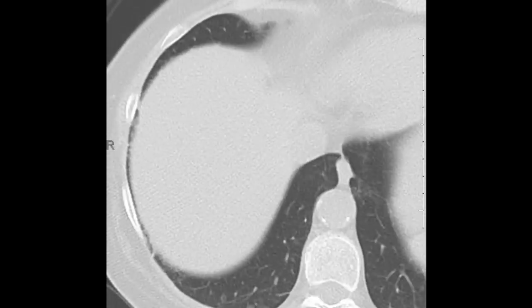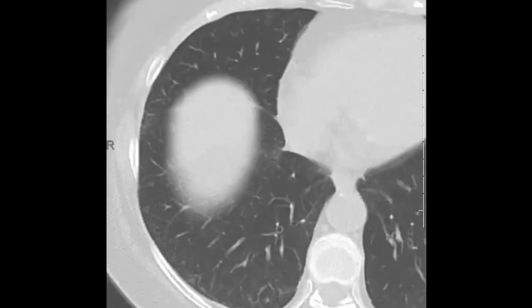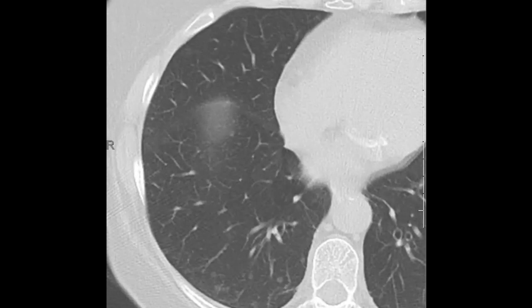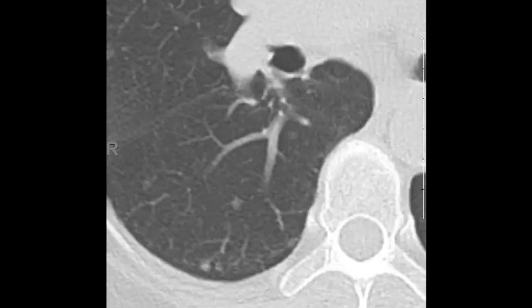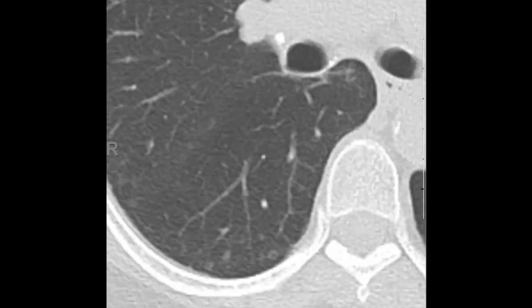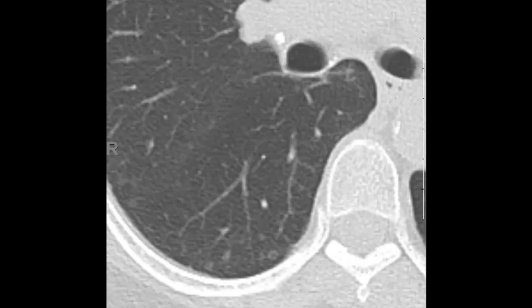It's a nice case of meningiothelial-like nodules. Other things to think about when you see the cheerio sign — these small nodules with a cheerio-like configuration — include cavitary nodules more broadly. Here's a nice example in the right lower lobe, and another one down here. The differential for cavitary nodules includes cavitary metastases, infection, vasculitic etiologies such as granulomatosis with polyangiitis, and even necrobiotic nodules from rheumatoid arthritis. But these smudgy, innumerable, basal-predominant nodules with the cheerio sign really feel like meningiothelial-like nodules — a rare diagnosis, but I don't think it's as rare as the literature says.